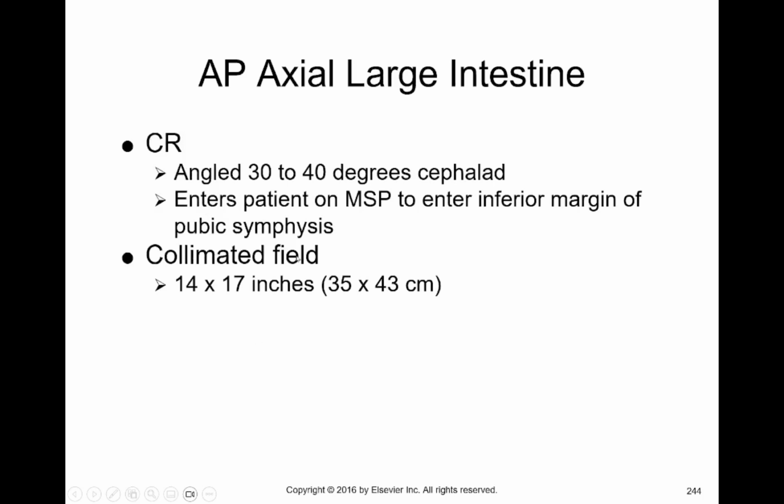So our angulation is going to be 30 to 40 degrees cephalic. It's going to enter at the mid-sagittal plane to the inferior margin of the symphysis pubis. I tell my students never to palpate the symphysis pubis. If your instructor is a symphysis pubis palpator, then certainly follow their instructions. I just personally see too much of a chance for some sort of litigation in that, so I tell my students not to do that.